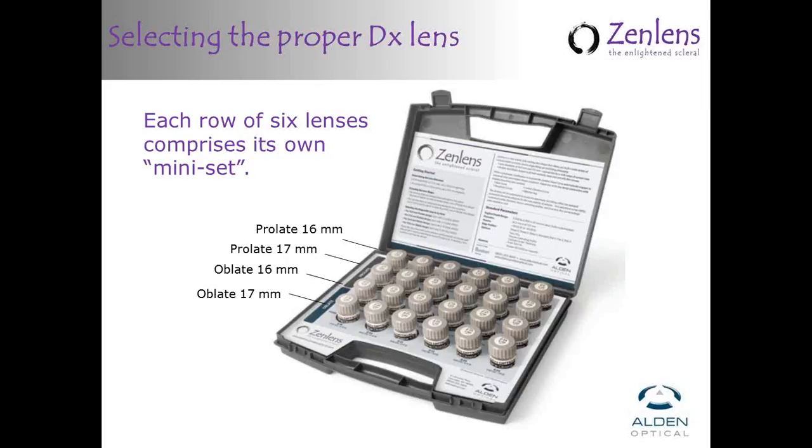I'm going to review some of the aspects of getting started on the right foot, as John mentioned. I've had the opportunity to work with other fitters who are using the Zenlens within the practices I've worked in, and I see other people fitting this lens as well. One of the things I've noticed is that other people don't always follow the rules for fitting. Sometimes when I get called in to help evaluate a fit that isn't going quite as expected, surprisingly, half the time we backtrack and realize that the initial selection of diameter or shape really wasn't appropriate for the patient. If we just back up and make sure that we have made the original selection properly on diameter and shape, we can resolve the issues and get a successful fit.